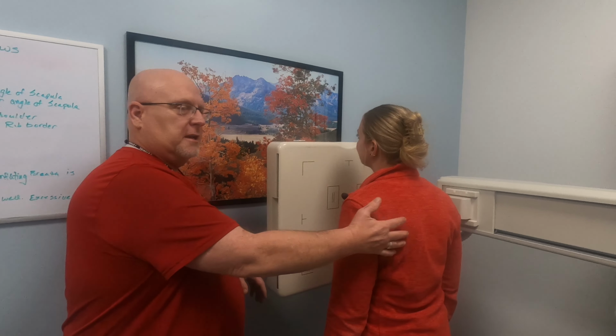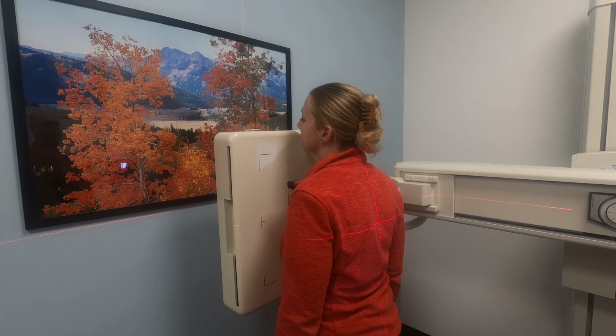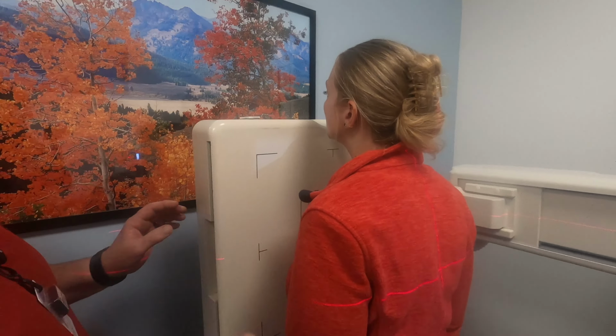We'll deal with that before we take the x-ray. Okay, so we're going to have the patient's chest up against the board. Okay, now, like I said before, we're going to have 1.5 to 2 inches of light above the shoulders. Okay, so we can see that right there.